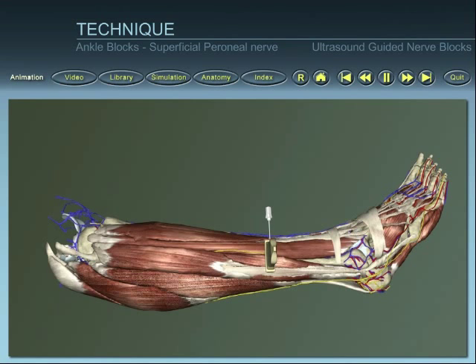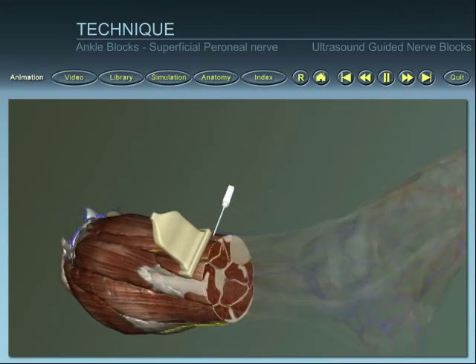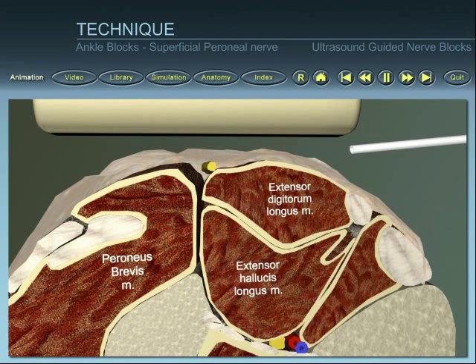Insert the needle at the outer anterior end of the probe. Identify the needle within the ultrasound beam, and direct the needle towards the superficial peroneal nerve.